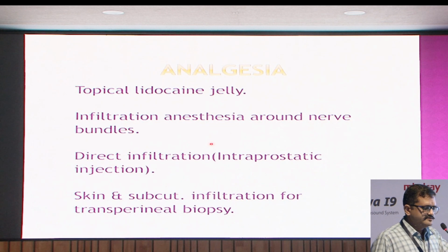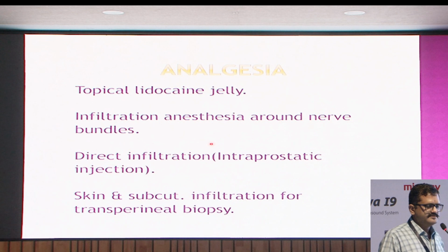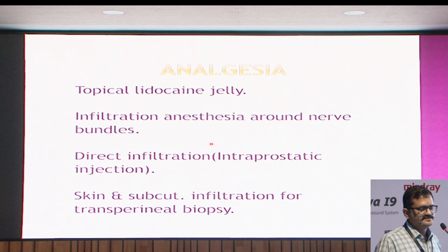Then we can give nerve blocks also, wherein we instill 1% lidocaine, about 10 ml, around the prostate 10 to 15 minutes before the procedure, so that it will act and give the nerve block. Direct infiltration into the prostate is also an option, but it is not as good. If we are planning for a transperineal biopsy, skin and subcutaneous infiltration along with deep sedation will be required, as it is a very painful procedure.